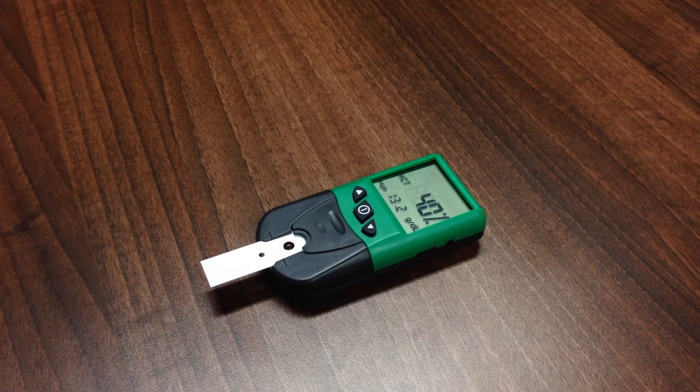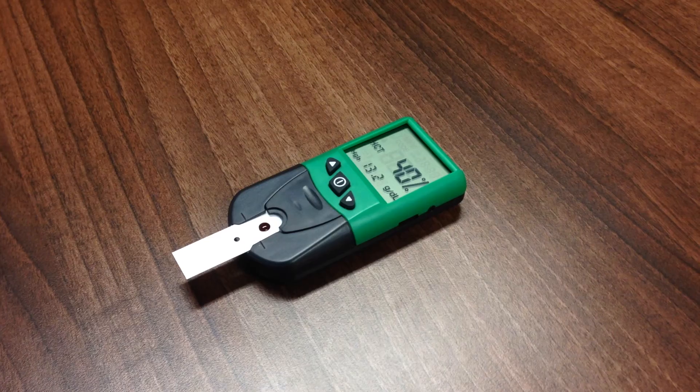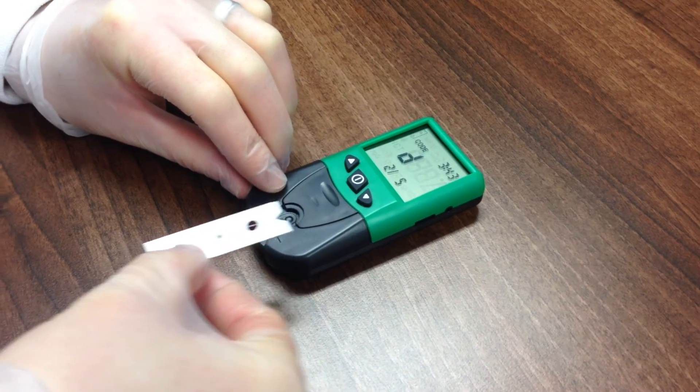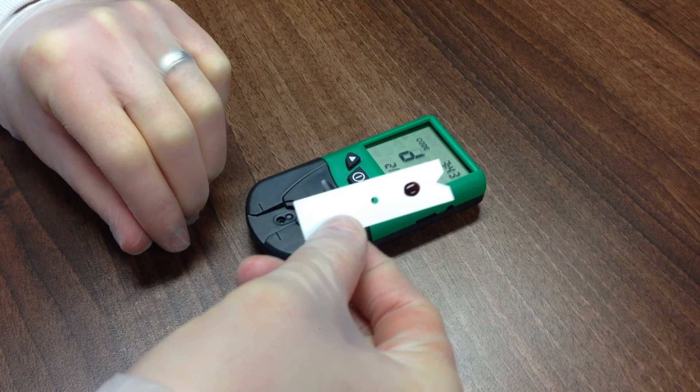HCT is reported as a percentage and a haemoglobin result will be displayed in grams per deciliter. Once the test is completed, remove the test strip and check if the test strip spot is completely covered by the blood. If the spot is not completely covered, an inaccurate result may report.